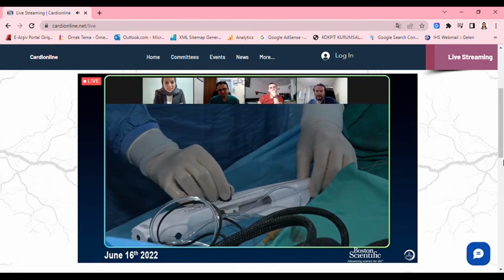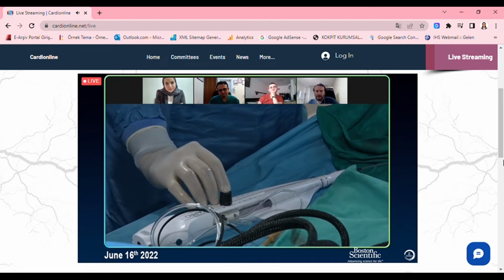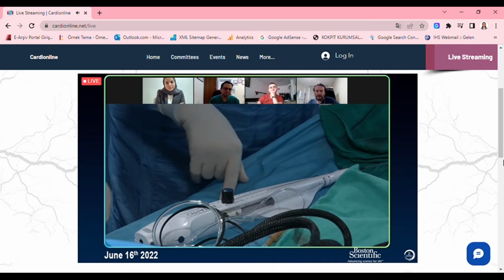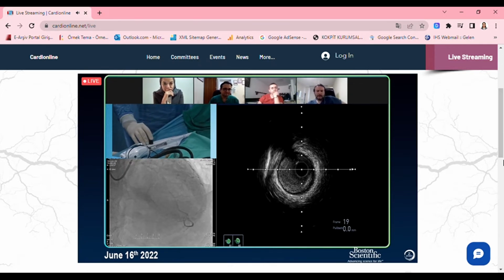You're going to do a test run. We push the advancer knob to start rotating the burr, and we will see it. We will test it. I like to have 185,000 RPM, it could be 180 to 190. Let's do it now.